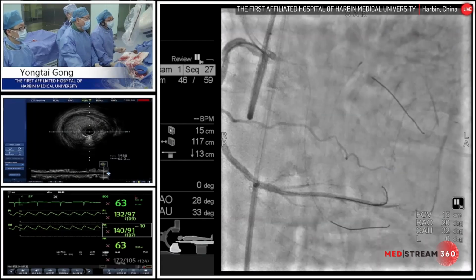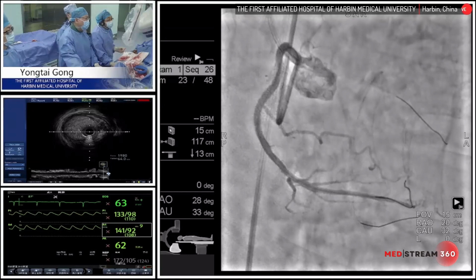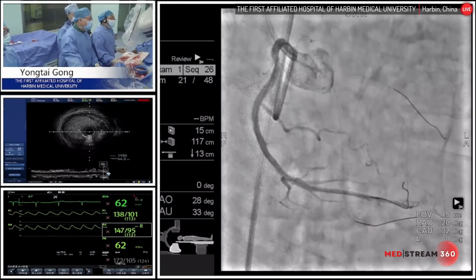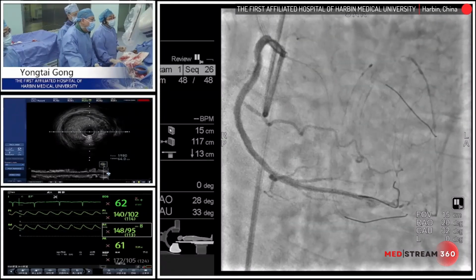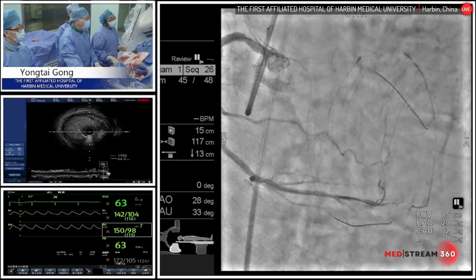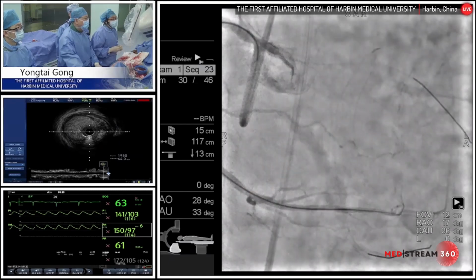So did we try the Caravel microcatheter, or change to another catheter? Change another. The proximal one may be a good choice. Okay, so you think the one proximal to this? But the proximal septal branch is close to the distal head of the CTO segment.